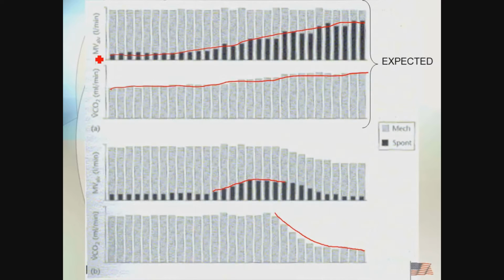This total thing is minute ventilation. Okay. And it's just showing what portion of that is the machine and the patient. Okay? So just a tool you can use to see, even before their blood gases would become profoundly acidotic, I already see that this process is happening. I'm already watching the failure happen before my eyes.